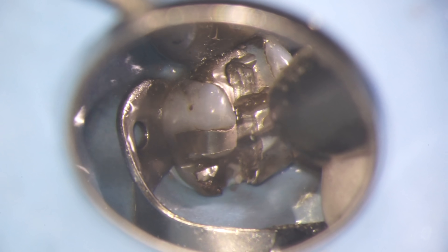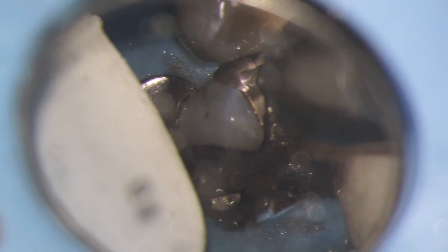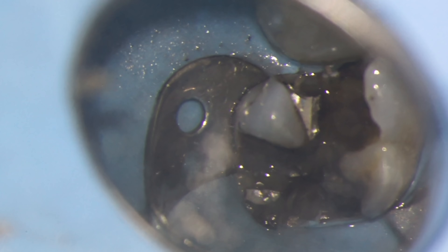There it goes, and there goes the second piece. There's the third, and before long we have the rest of the silver filling out. Now invariably there's a few little pieces left behind, so we have to get those out as well.